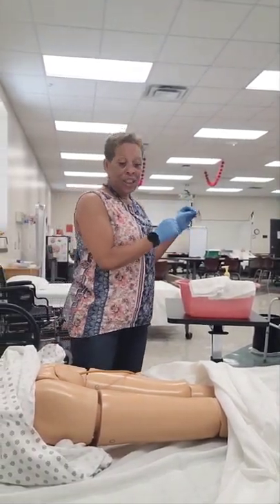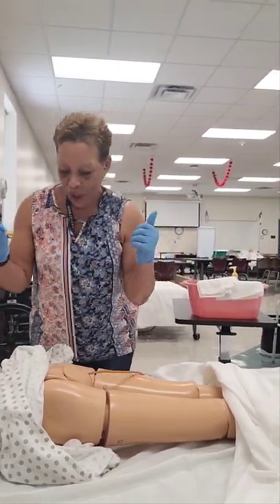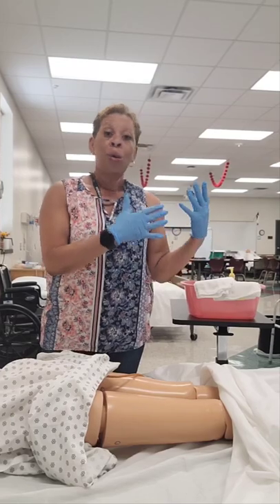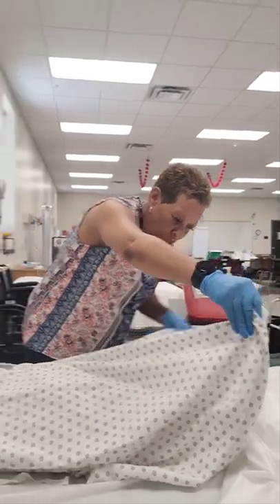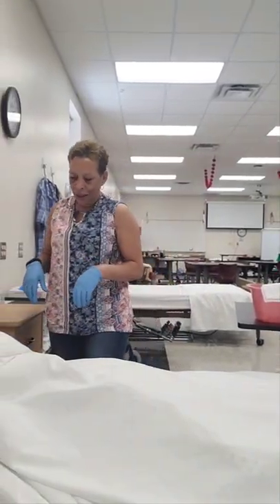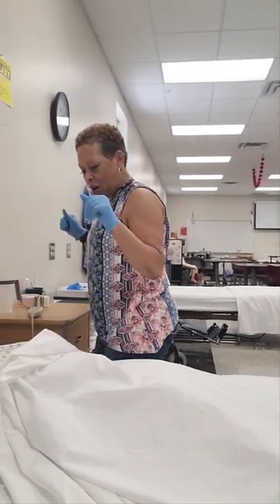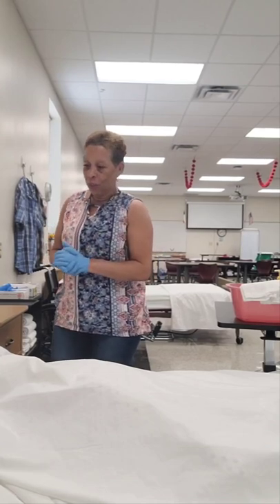If you used a towel for the linen protector, dispose of it in the soiled linen hamper. Now I'm covering Mrs. Jones back up — starting with elbows, though the NAE will usually tell you to just use your hands. She still has her call light. Mrs. Jones, I'm all done cleaning your catheter. Your bed is still in a low, safe position, bed wheels are locked, you still have your call light. Is there anything I can do for you before I leave to dispose of my supplies?